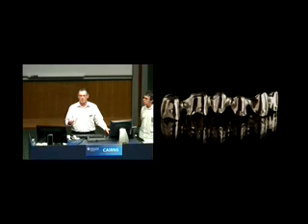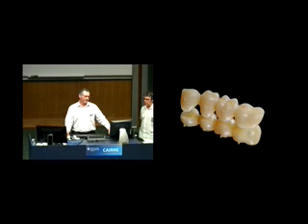Not as in cobalt chrome partial dentures. So it's a cost-effective cobalt chrome alloy. We also have it available in titanium with a veneering ceramic that bonds onto the titanium. It's for some full contoured crowns, as in Emax and Telio CAD. This is a Telio CAD temporary acrylic material, and we'll get into that a little bit more.